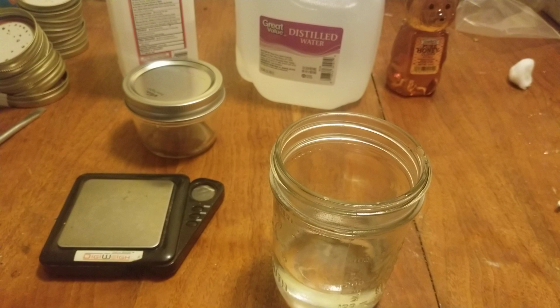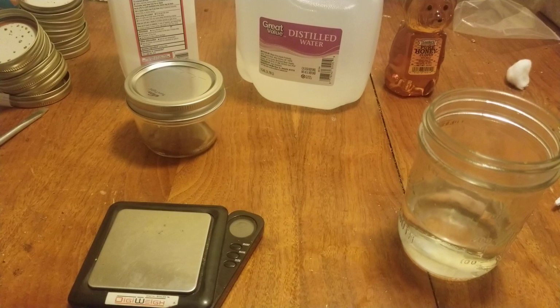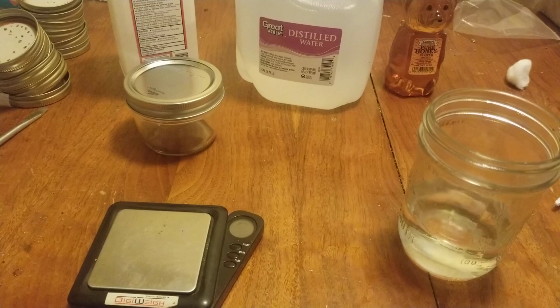What we're going to want to do to get started is, I like to always prepare with gloves. We're going to need a couple things. You're going to need a scale to weigh things. You're going to need some distilled water. Distilled water is preferred, but you can use your regular sink water. It's also preferred if you have filtered water.